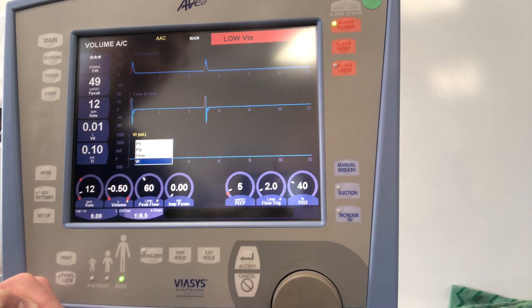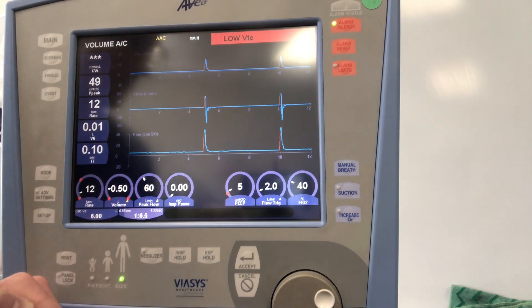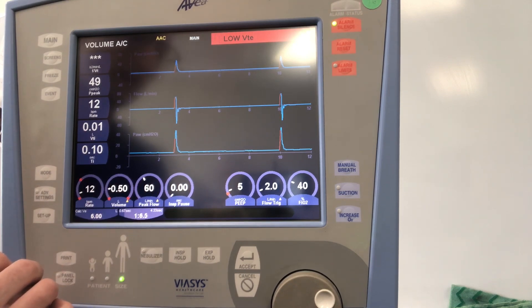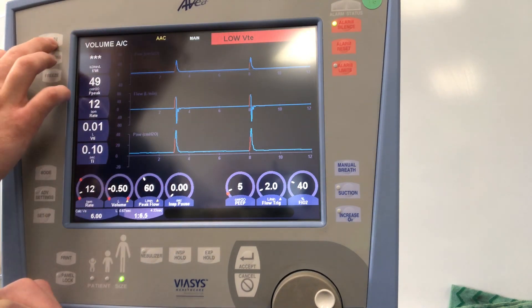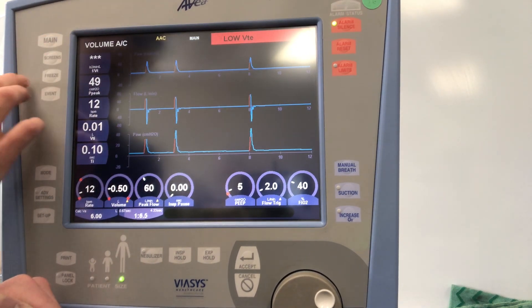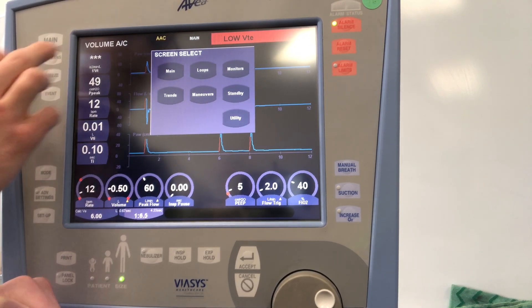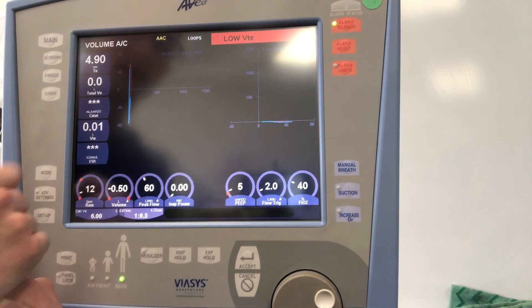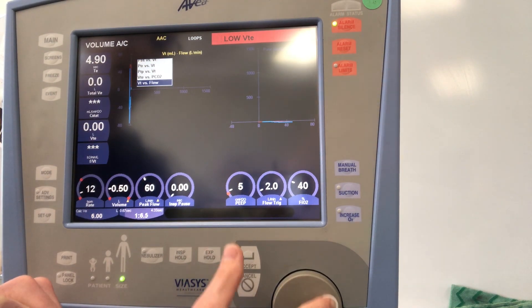Waveforms themselves can be changed — tap under the label and you can change it, then tap again to accept. There's also an accept button available if the touchscreen isn't picking up your fingers too well. To display loops, go to Screens, hit Loops, and you can modify these loops into whatever you want to see.